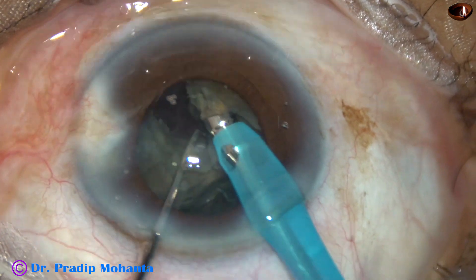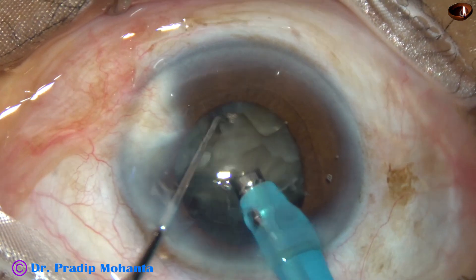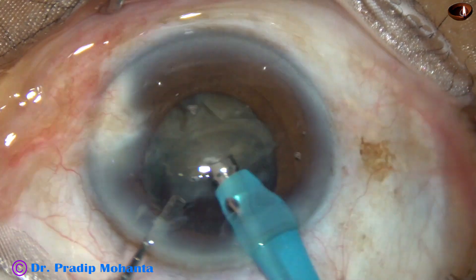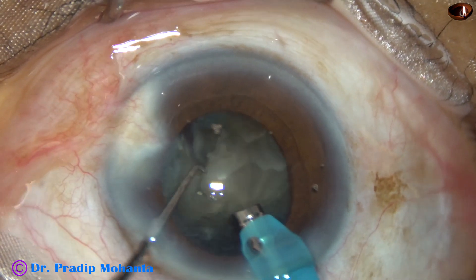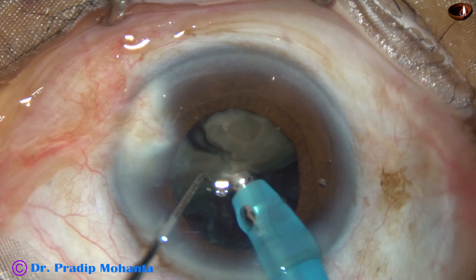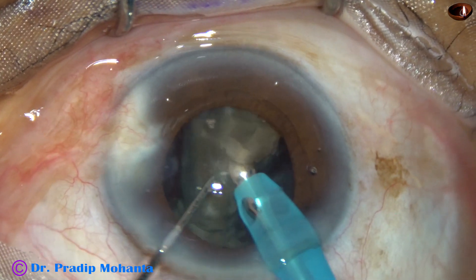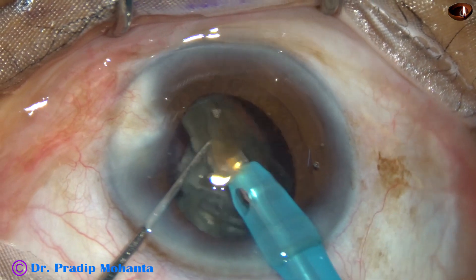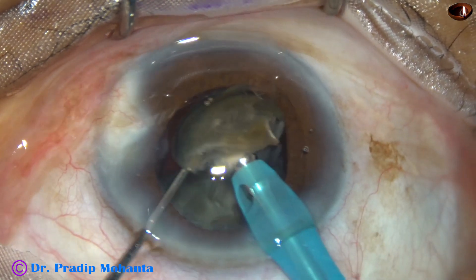This is the other heminucleus. There is a nice crack, but the two pieces are still not free — they are joined to each other at the central part. I tilt the two pieces, apply some energy, and the two pieces get separated. Ultrasonic energy is applied, and each nuclear piece is emulsified and removed.